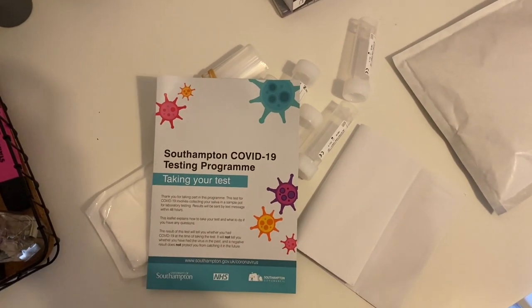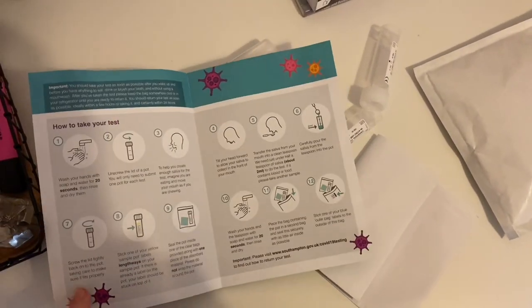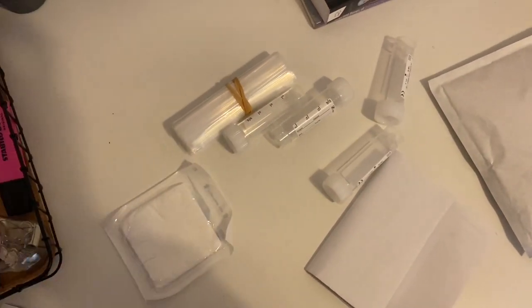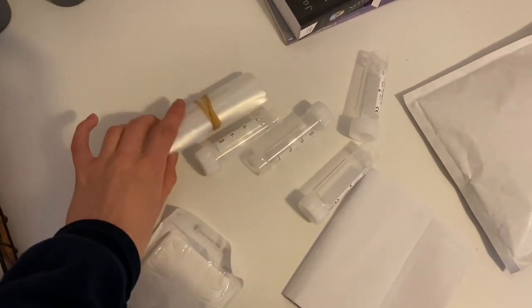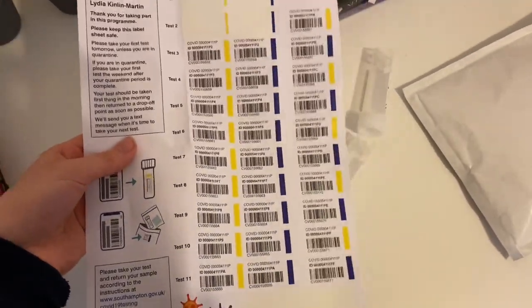So this is what you will receive inside the testing pack. You get a copy of the instructions — a leaflet with everything written really clearly. You have some sample testing pots, some absorbent material, plastic bags, and most importantly, stickers that you put on your sample pots to identify who you are. Before taking your test, I'd really recommend thoroughly reading through the instructions, because if you don't do it correctly your test could be void or the results might be incorrect.